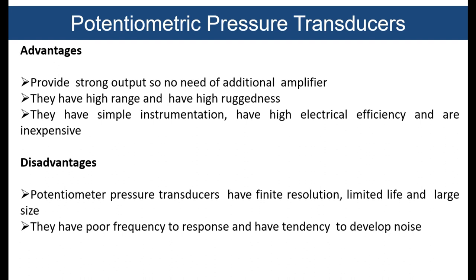As it has advantages, it also has disadvantages: the resolution of this potentiometric pressure transducer is finite, that is, it's limited, okay, and it has a limited life. Why am I saying this? Because once the bellows tube is disrupted, you will not be able to get a precise reading of the pressure.